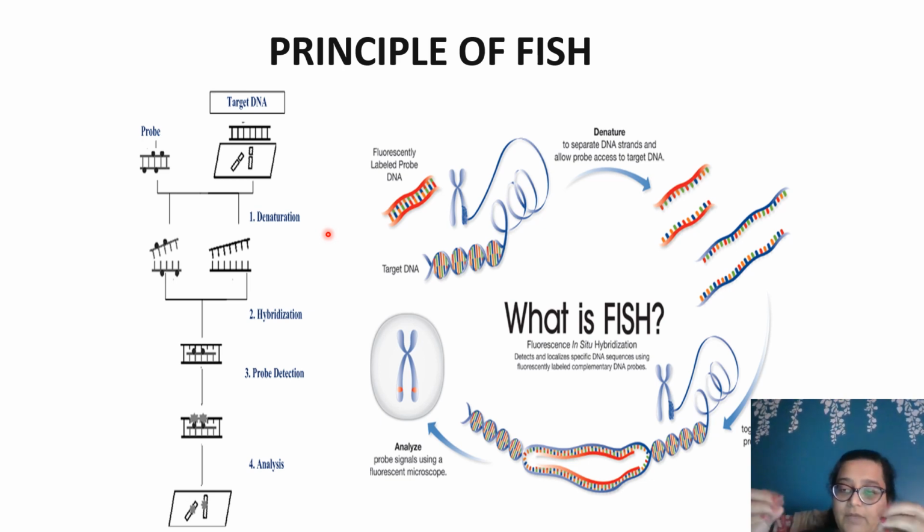Now, this can be done when we are doing RT-PCR, which is part of molecular. Supposing you just want to observe in FISH, you just want to simply see whatever number of cells you have cultured and spread on the slide, then you don't need to put the sample in a thermal cycler. You just read the number of signals, say in 100 cells, 50 cells showing this kind of mutation, where this market available 9;22 mutated DNA probe went and attached to the complementary site on this DNA fragment, and this fluorescence gave a light, and that light you could see in the microscope. So this goes both ways. It can go into the molecular spectrum, or a simple pathologist can also do it by fluorescent microscopy.